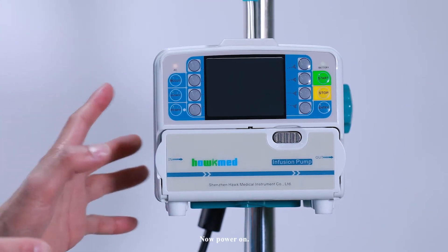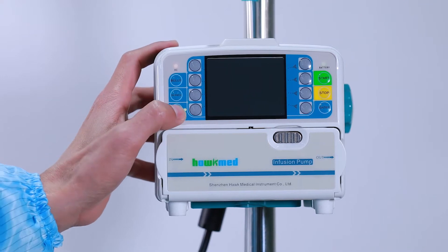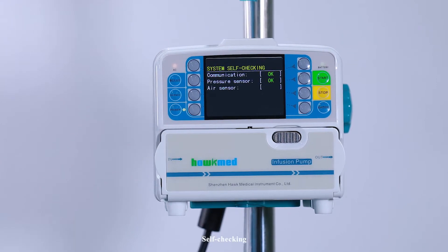Now, power on. The pump will begin self-checking.